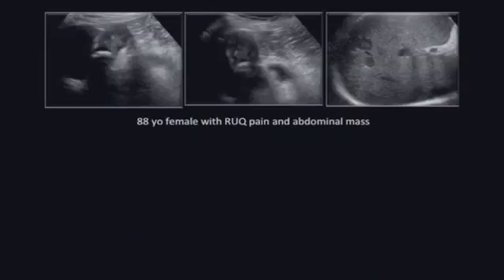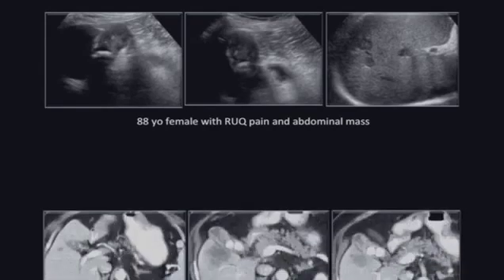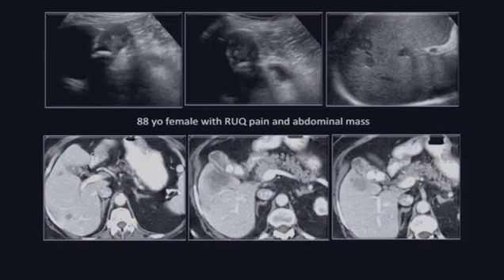Another older female presenting with right upper quadrant pain. Here's the gallbladder, which is filled with soft tissue mass, gallstones. The evaluation for direct liver invasion is limited on this ultrasound study. Looking for evidence of metastatic disease, we see multiple small hepatic lesions. Again, the findings are most worrisome for gallbladder cancer with liver metastasis.